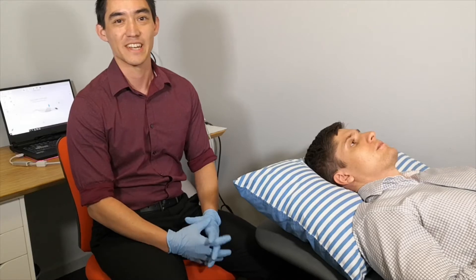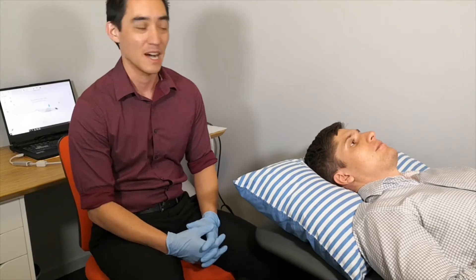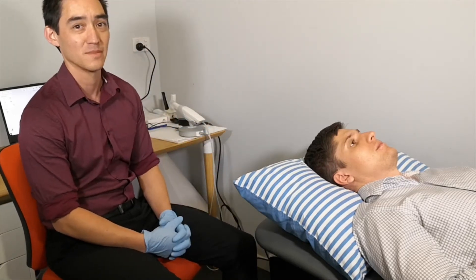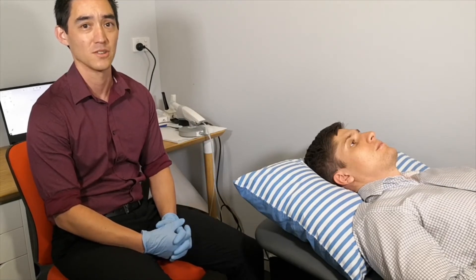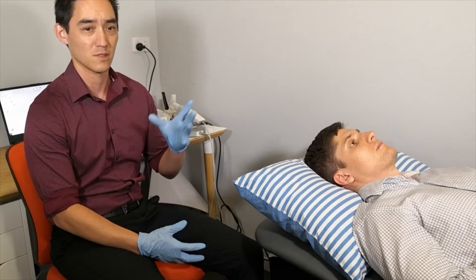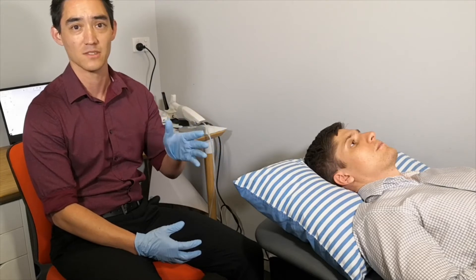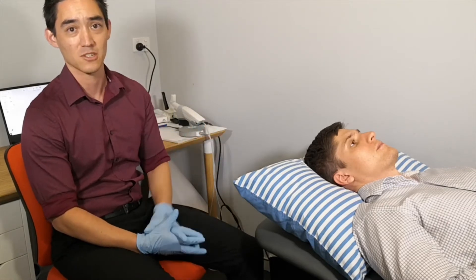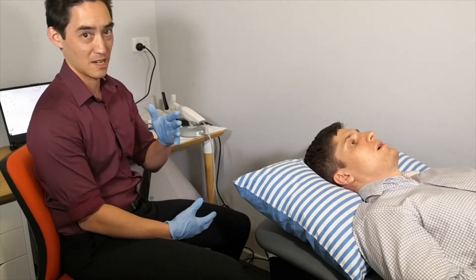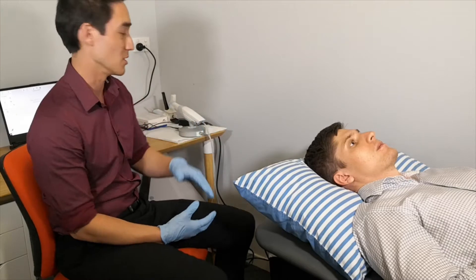We're going to be demonstrating today how to take intraoral scans and a bite registration for a mandibular advancement splint. Today we're going to be using the 3Shape Trios system. It might change a little bit depending on what digital scanning system that you use. With a mandibular advancement splint we need to have the full arch of the teeth, ideally to the very distal of the sevens or even the mesial of the eights if they are present. Firstly we're going to take the scans in the Trios system — we start with the lower arch and then we go to the upper arch.